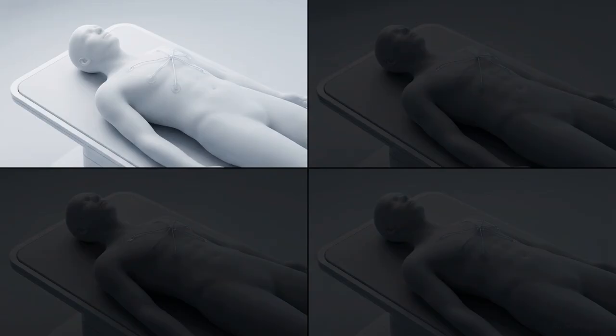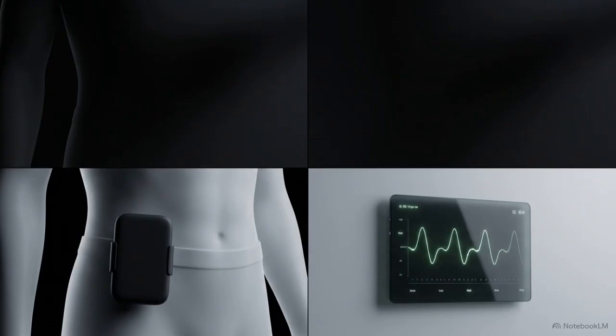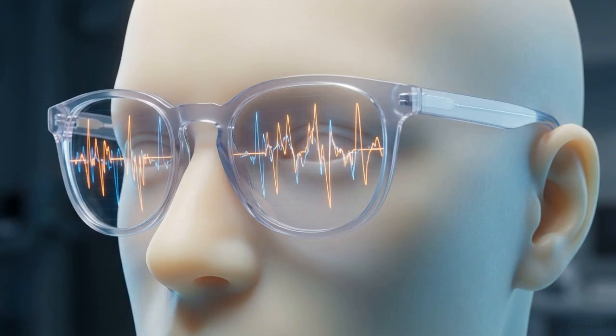This recording occurs across 4 primary environments: standard resting ECGs, physical stress ECGs to assess the heart under load, continuous Holter monitoring via portable devices, and real-time telemetry for critical hospital patients. Flawless physical protocols and appropriate hardware selection are mandatory. Any data artifact can mimic the presentation of a fatal cardiac event on the final readout.